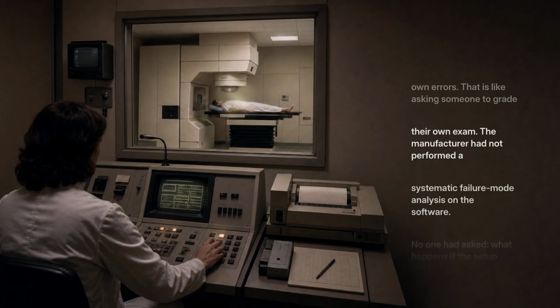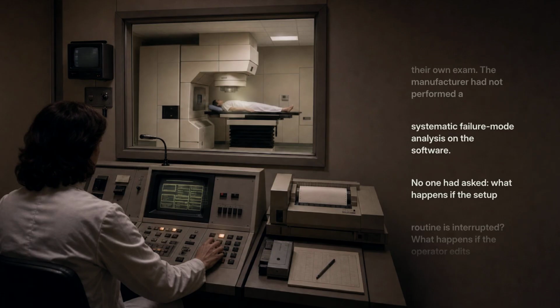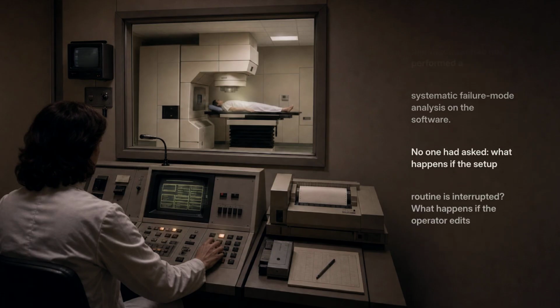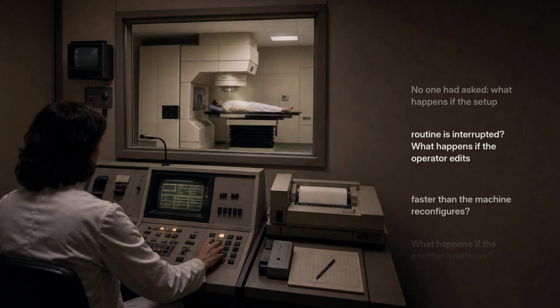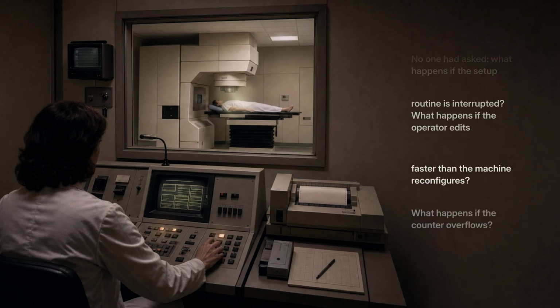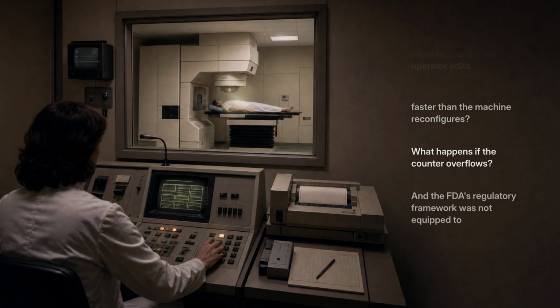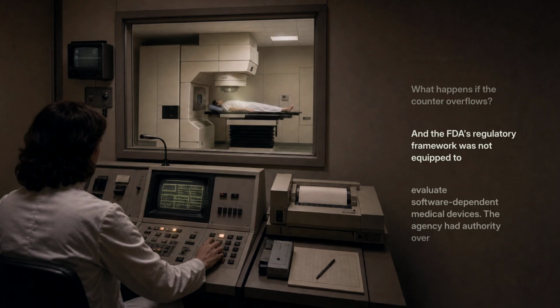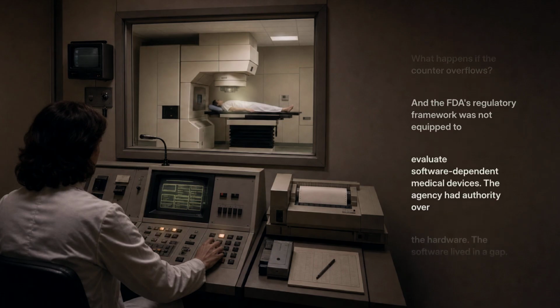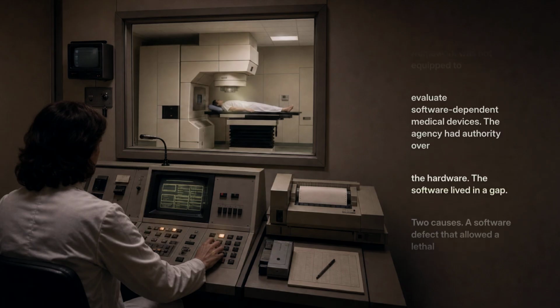The manufacturer had not performed a systematic failure mode analysis on the software. No one had asked, what happens if the setup routine is interrupted? What happens if the operator edits faster than the machine reconfigures? What happens if the counter overflows? And the FDA's regulatory framework was not equipped to evaluate software-dependent medical devices. The agency had authority over the hardware. The software lived in a gap.